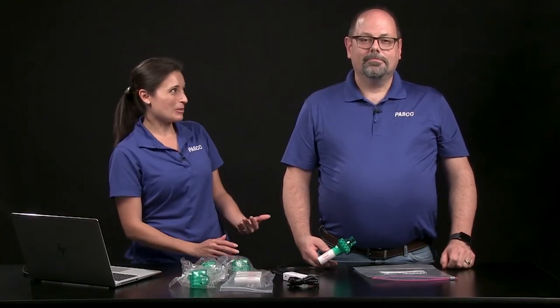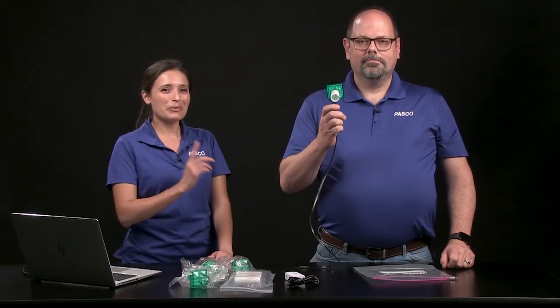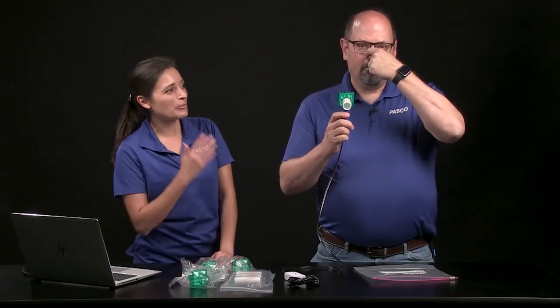The test subject must remain as still as possible during the entire test. Before starting the test, the data collector should walk the subject through the procedure. You can only breathe through your mouth during the test, so you have to pinch your nose closed with one hand and hold the spirometer handle in the other hand. Hold it upright and straight.